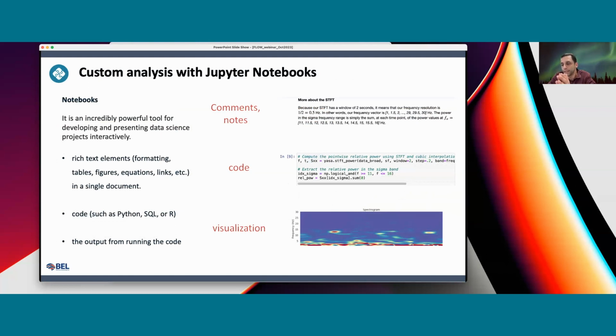We're working to enhance our set of supported workflows, but due to development time and the time that we spend on verification and validation of each product, it just takes time. So to bypass this, we decided to add to Flow the ability to communicate MFF files with Jupyter Notebooks.